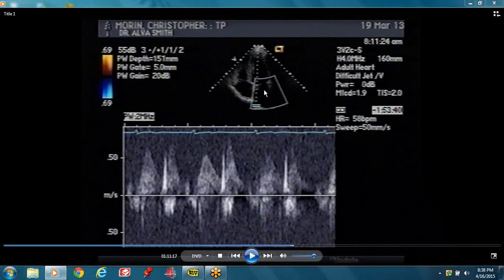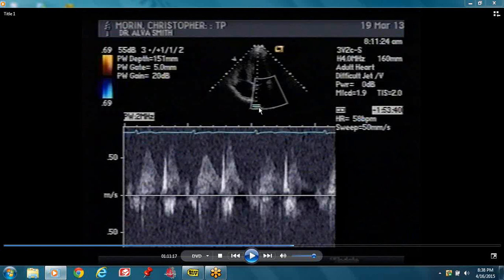In the four chamber view, you have one pulmonary vein here and the next one over there — this is the right lower and this is the left lower. The pulmonary veins drain into the left atrium, so it's flowing towards the transducer. Pulmonary veins flowing into the left atrium with the transducer there — you get a systolic component and a diastolic component. In a normal individual, the systolic component is probably a little bit greater than the diastolic component. Then you get what we call an atrial reversal down the bottom.